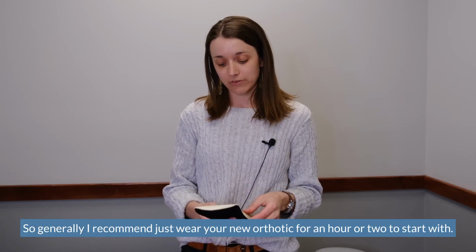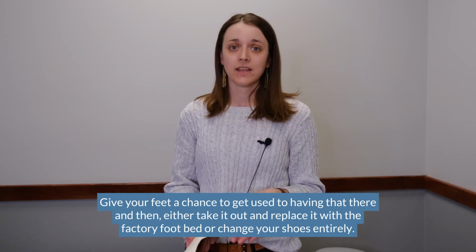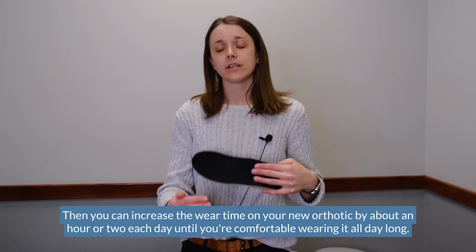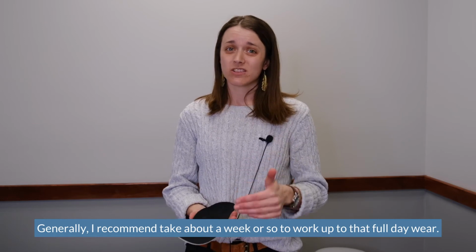So generally I recommend just wear your new orthotic for an hour or two to start with, give your feet a chance to get used to having that there, and then either take it out and replace it with the factory footbed or change your shoes entirely. And then you can increase the wear time on your new orthotic by about an hour or two each day until you're comfortable wearing it all day long. Generally recommend take about a week or so to work up to that full day wear.